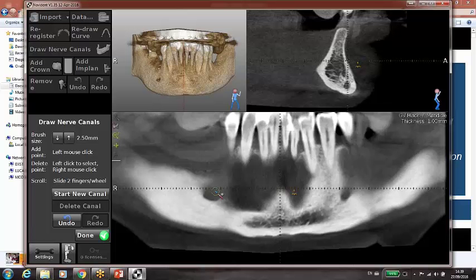So it is important to understand that you can vary the diameter of the brush. The lower diameter is 2.50, the higher diameter might be 5 millimeter, 5.50, you name it. But the lower diameter is 2.50. Okay. Minimum.